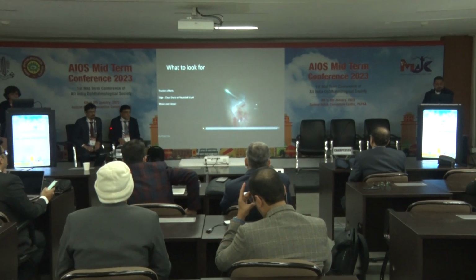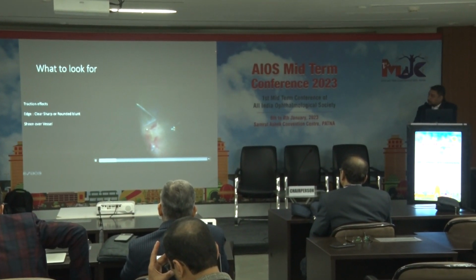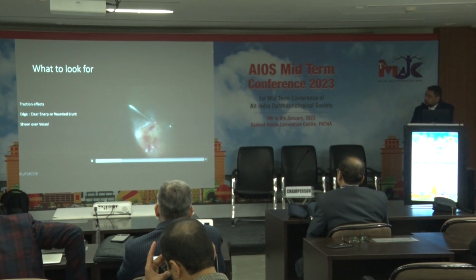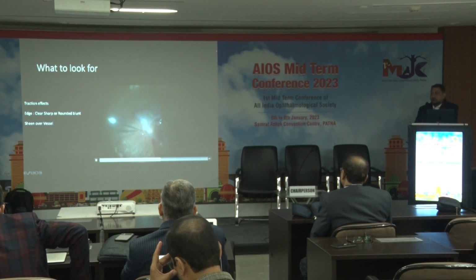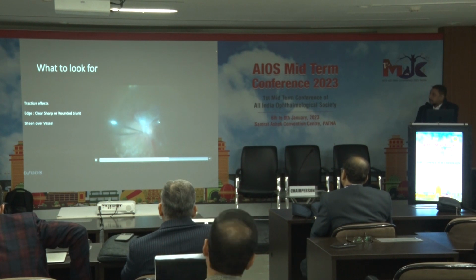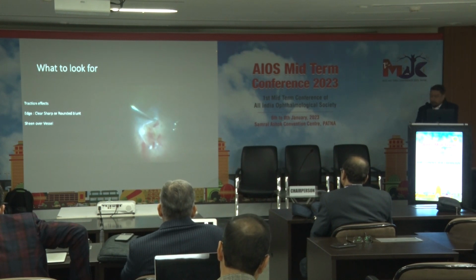This is another video which is going to just show you two different sides of the same polyp. Here you can see a very sharp margin, and the tractional effects are minimal. But when you come to this side, you can see a blunted edge where you don't see the margin very correctly, and you know that at this particular point the second membrane is still there, and that is what the PIC is doing now. It is trying to delineate and separate the membrane from the surface of the polyp. So it's a vitreous sheet starting from the polyp and going on to the retina, keeping it stuck down.